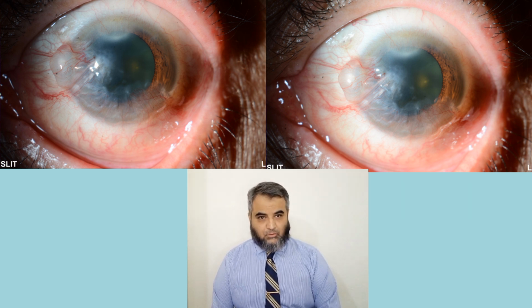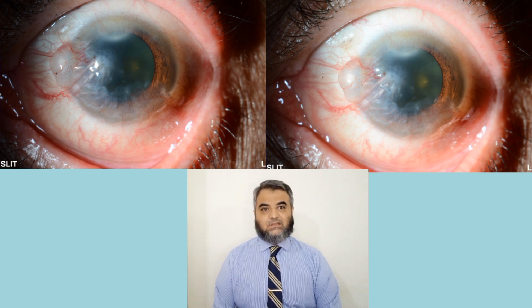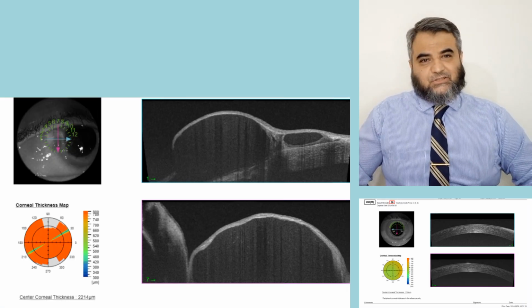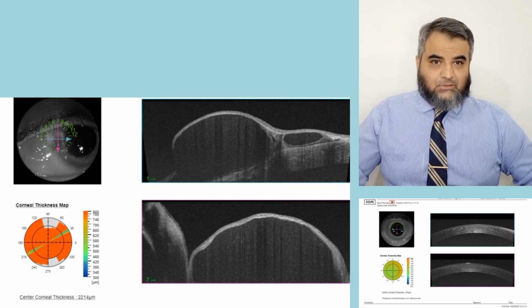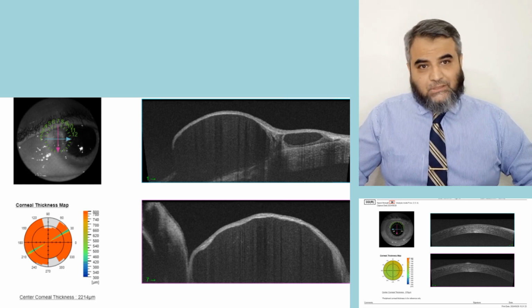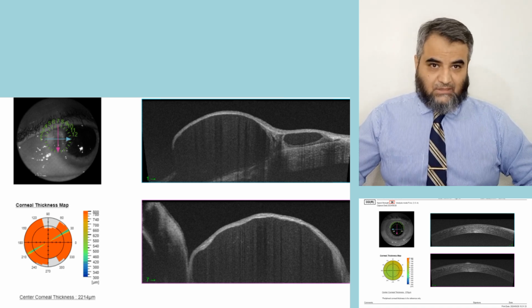This is a non-routine presentation of the pterygium, which needs to be investigated further, to see whether this is a benign lesion or it has a tendency for malignancy. So this thing has to be kept in mind. These are OCT anterior segments. Usually in such atypical presentations, and even routine pterygium cases, we have to take the help of histology.